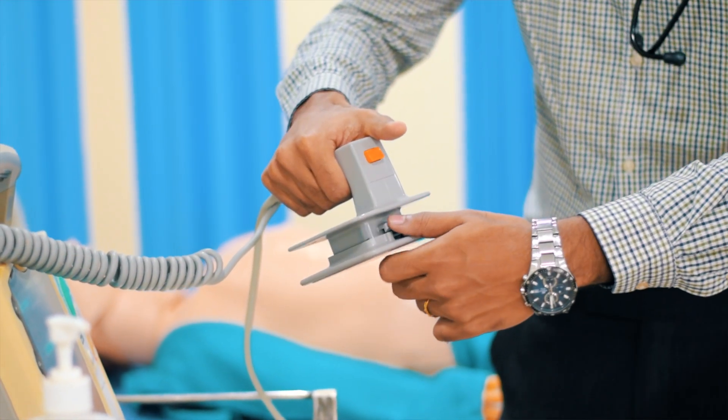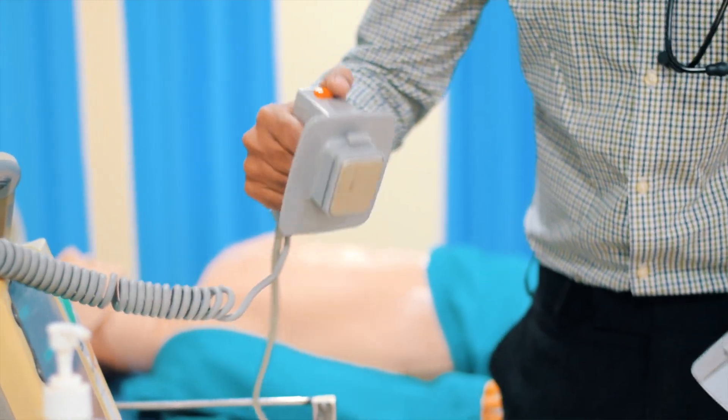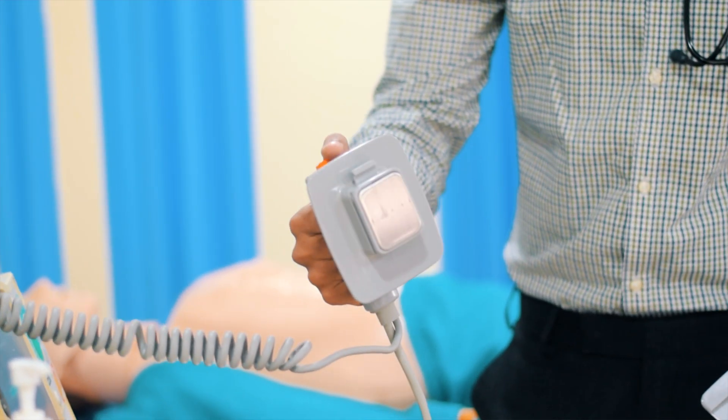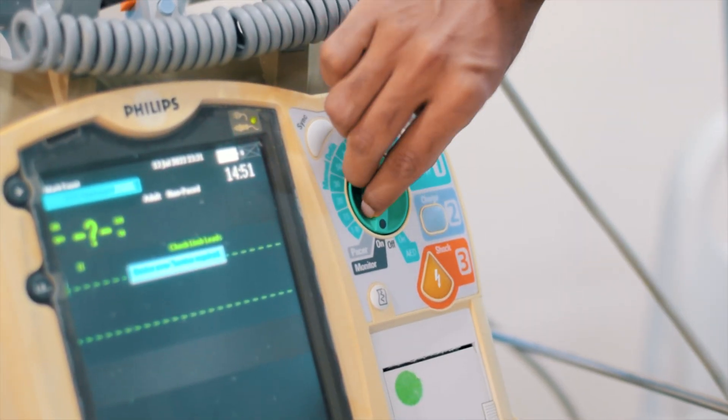To use pediatric pads, unlock and slide out the adult pad. You can also use this defibrillator as an AED by turning the knob to the side where it says AED.